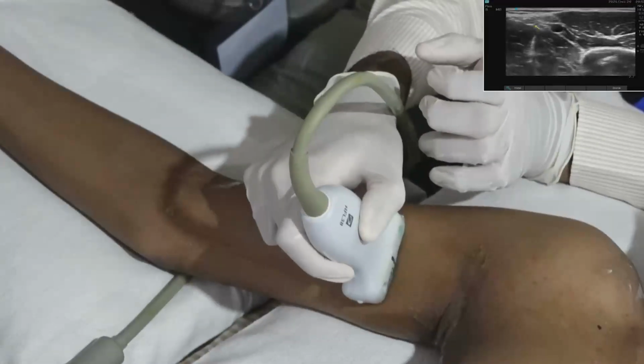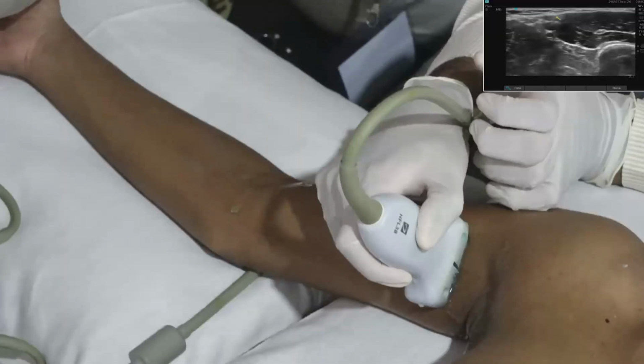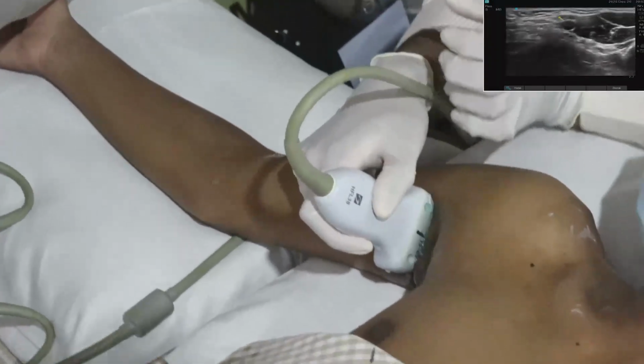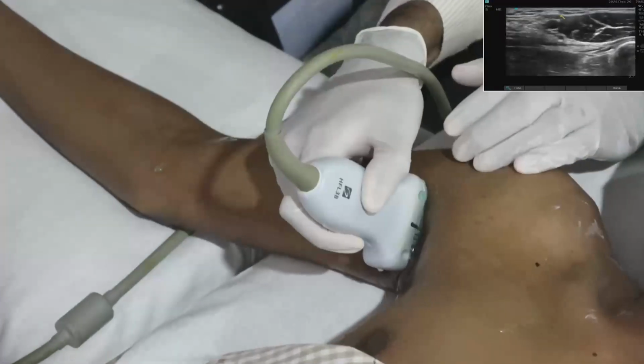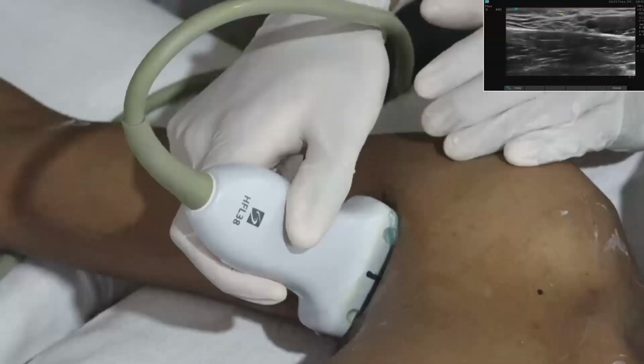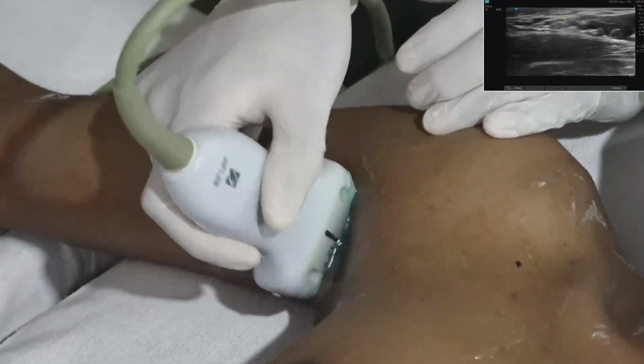Now the position might be a little different clockwise, but it is always next to the brachial artery, though with a variable clockwise position, up to the axillary artery. Sorry.